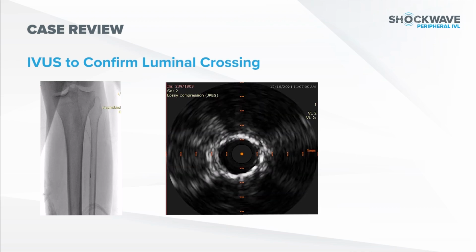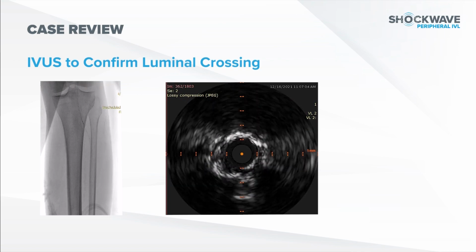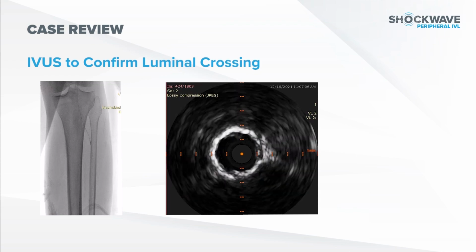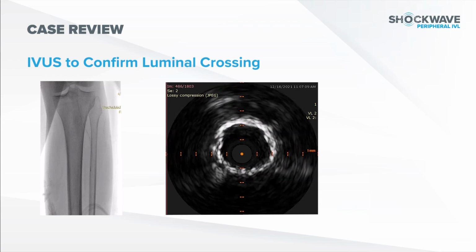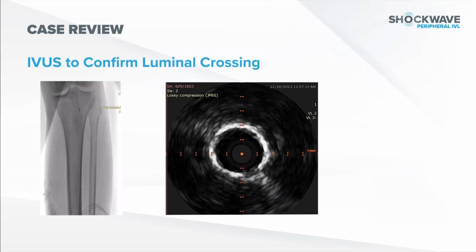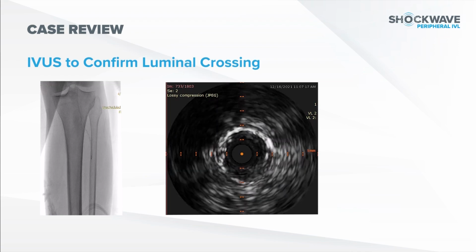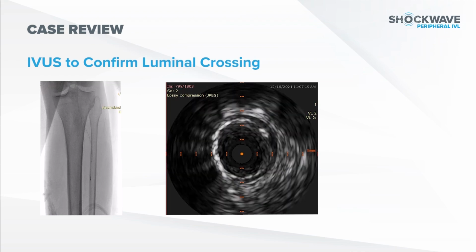And my goal, ideally, instead of taking a distal shot with some contrast to a crossing catheter to see if I'm luminal, I prefer not to, because every couple times when you do that, you end up being subintimal, and then you just fill in the subintimal space with contrast and blood. And so I like to try to IVUS if I can, and you can see nicely on the image here, I'm luminal. You can see that calcium burden, which I really could not see on that image.